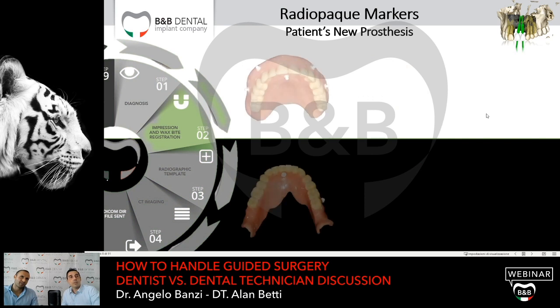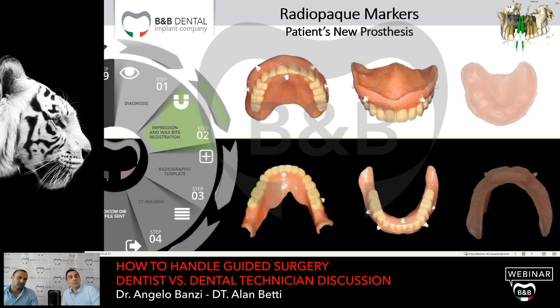Okay, let's move on, because of this prosthesis of the patient, that is actually a new prosthesis. I'm going to remind you that my patient came to my clinic without any rehabilitation in his mouth. So I have to do everything from the beginning.